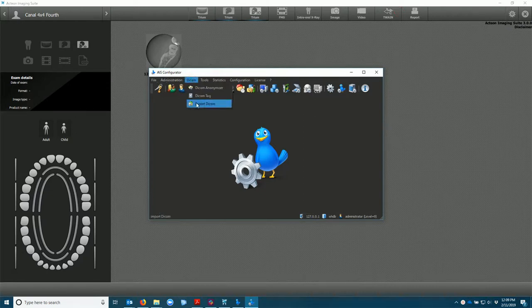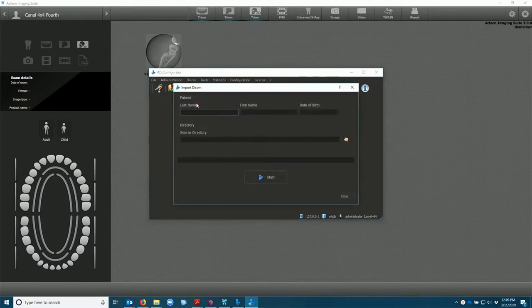We're going to go to import DICOM. Go to source directory.